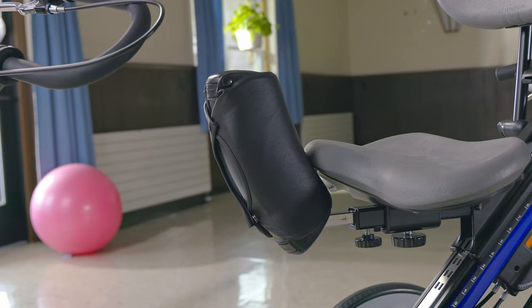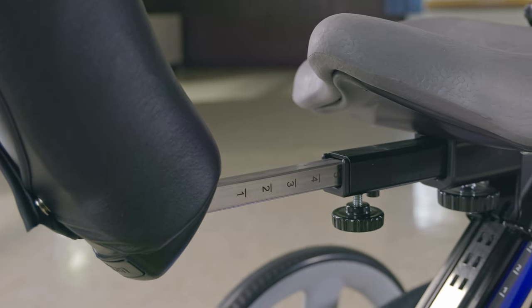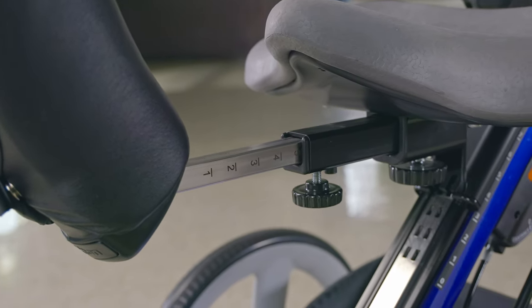The abductor is designed with substantial width, which not only prevents scissoring but also maintains the hip in a near-neutral alignment. These index markings allow you to document the depth placement. The pad is tall enough to give support as the rider's knees move up and down while pedaling.